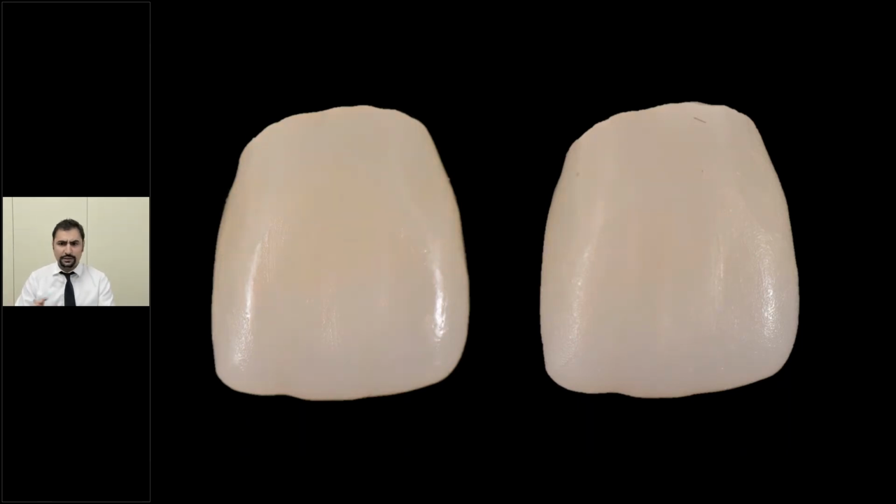So you can see how much it can affect the final shade of your zirconia crown. And if you look at it on a black and white background, you can appreciate the fact that the right crown has higher value. So again, we go back to the same discussion. Your sintering oven is very crucial. If you get the best zirconia, you still need to figure out what the optimum sintering temperature is. You need to find out how much hold you need to have. You need to calibrate your sintering oven so you get constant good results at the end.